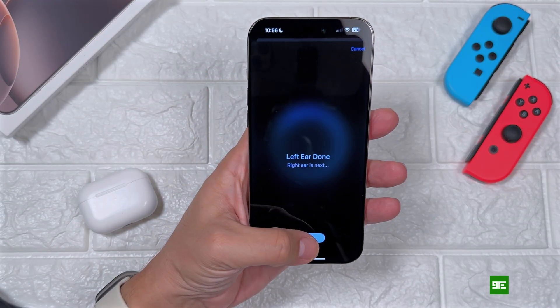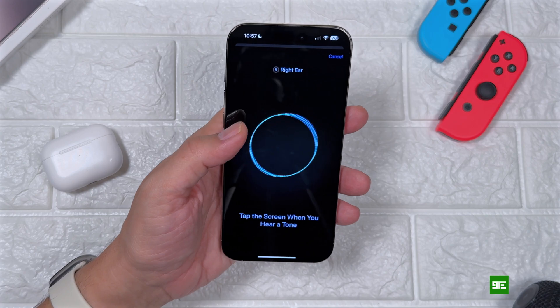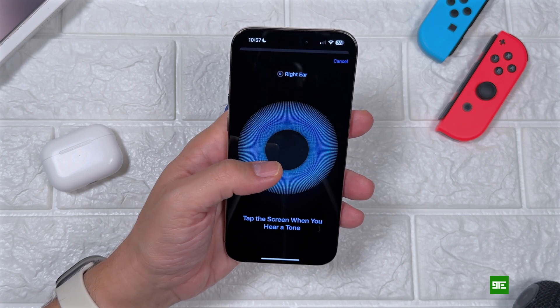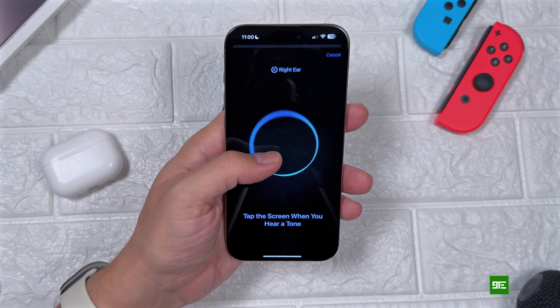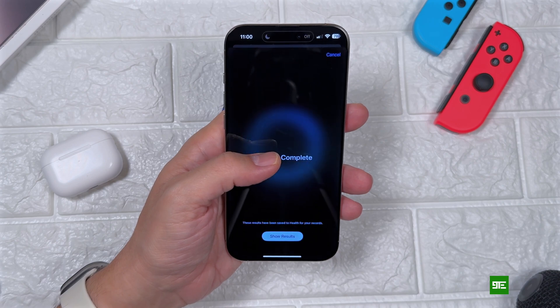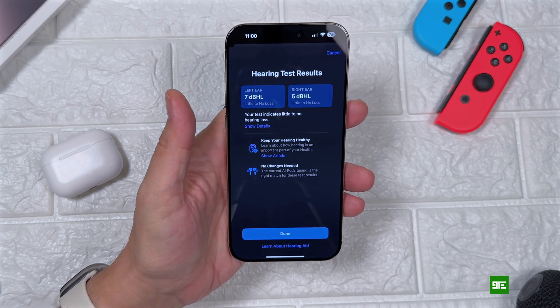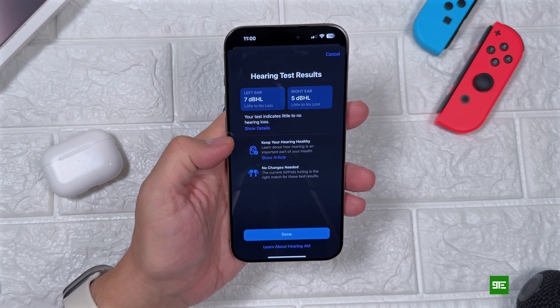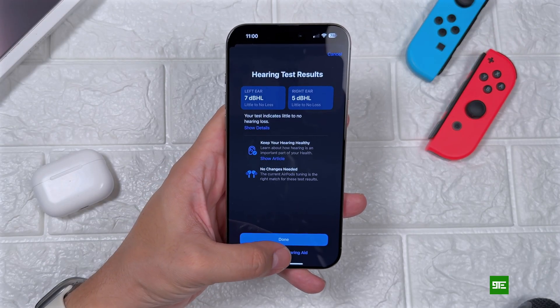You will continue with the left ear, and once everything is okay you will continue with the right ear, so that you can take the test for both ears. Once the test is completed you will see your hearing test results, which will also be available in your Health app in the hearing section.